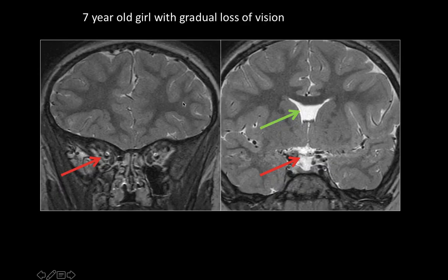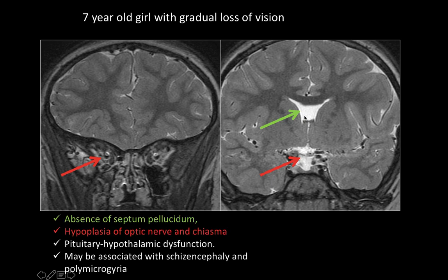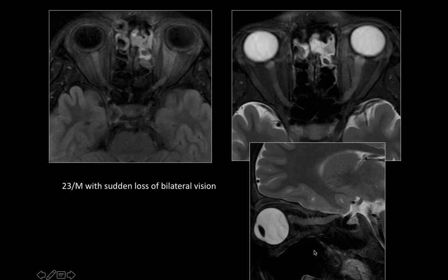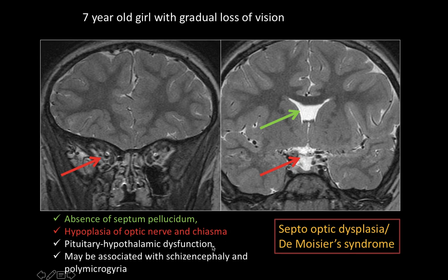This is a seven-year-old girl who had gradual loss of vision. We see very thin optic nerves associated with dilated or prominent subarachnoid space in the optic nerve sheath. Also note the optic chiasm is very thin and there is absence of septum pellucidum. This is septo-optic dysplasia, also called De Morsier's syndrome, associated with pituitary and hypothalamic dysfunction, or may be associated with schizencephaly and polymicrogyria.